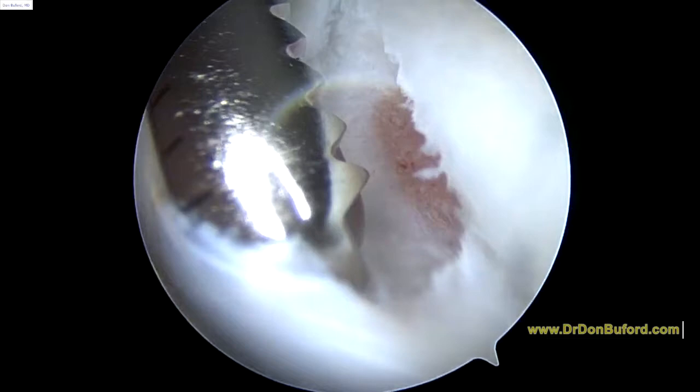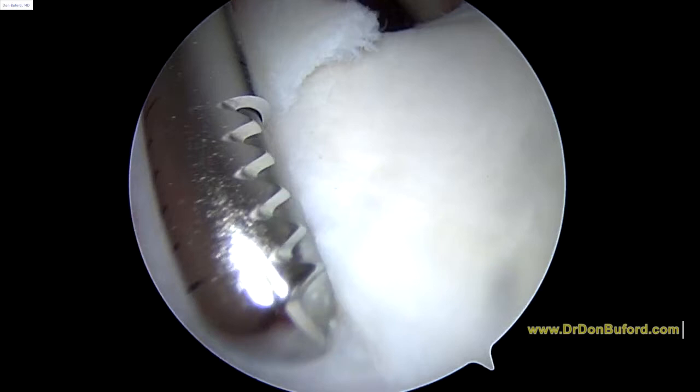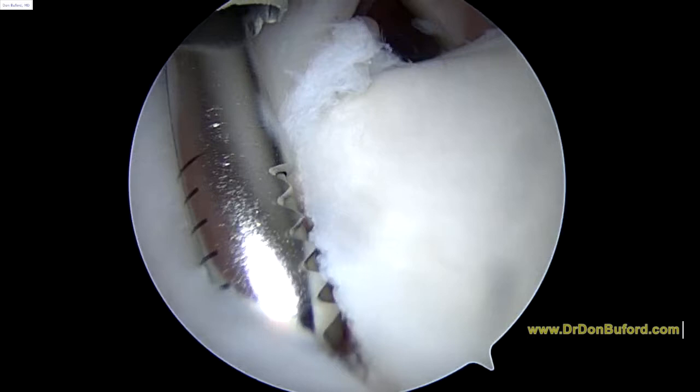All we're trying to do here is see this bone — how the bone is exposed underneath the cartilage. That's what we're trying to do here. I'm going to extend this a little bit farther posterior, all with the design of creating a nice, broad-based area for healing.